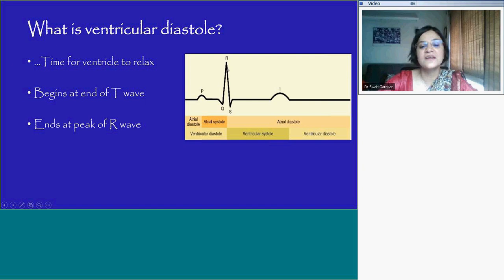Where it ends is at the peak of the R wave right here.